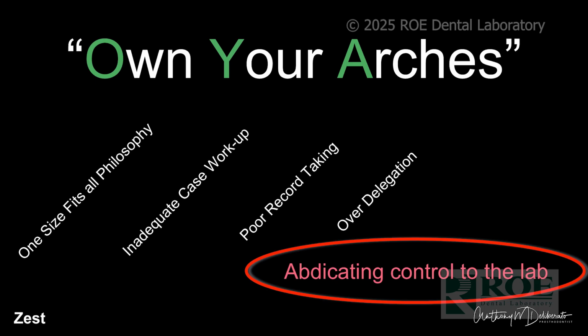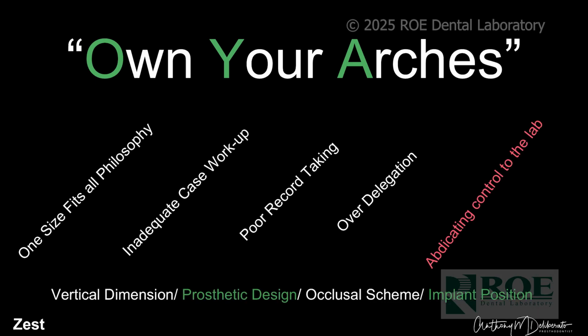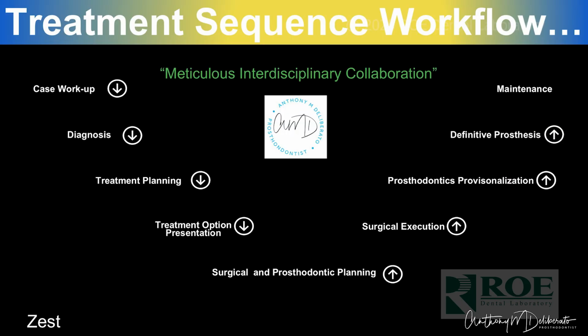Almost done with this spot. So you should be determining vertical dimension. You should be determining the prosthetic design. You should be determining what occlusal scheme you have.